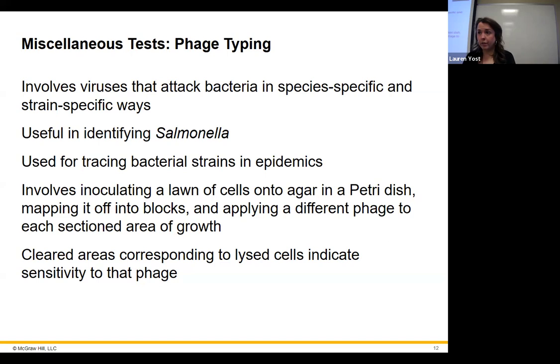If there is no infection, it's probably not Salmonella. It's probably something else. If there is, then it will be Salmonella. It has to be. So you can use that to identify as well. It says, even specifically here, it's useful for identifying Salmonella, especially since there are so many different strains of Salmonella.